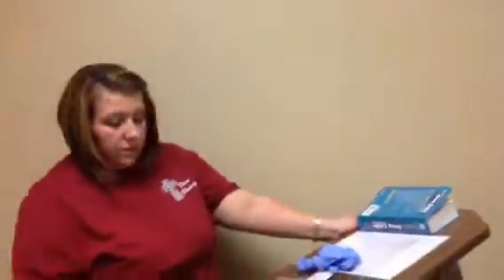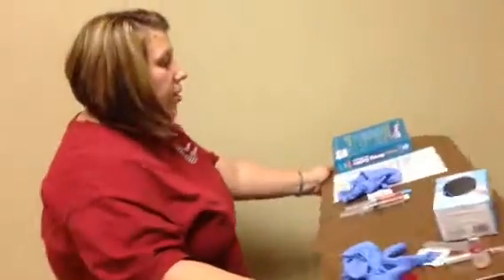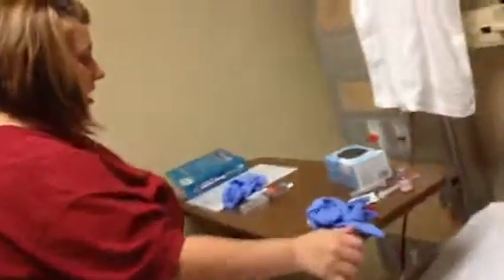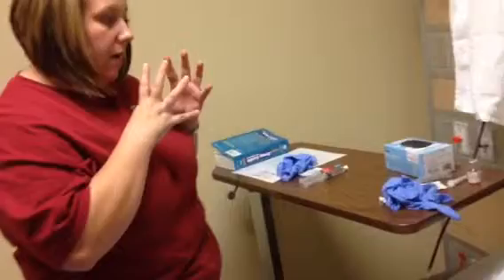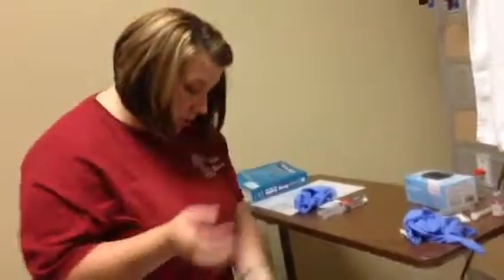Hello. My name is Tara. I'm going to be your nurse today. I heard you were in some pain. Well, I got you some medication. But the first thing I need to do is verify your identity. Can you tell me your name?